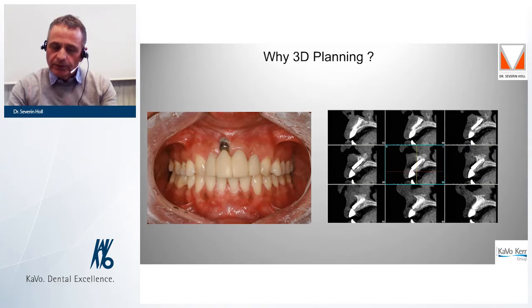You will hardly believe it was already the second attempt of implantation. This is only the picture, which does not come from our practice. The patient came to my friend Professor Axel Sparr in Sydney for surgery. A prior CBCT and a backward planning could have prevented this failure.